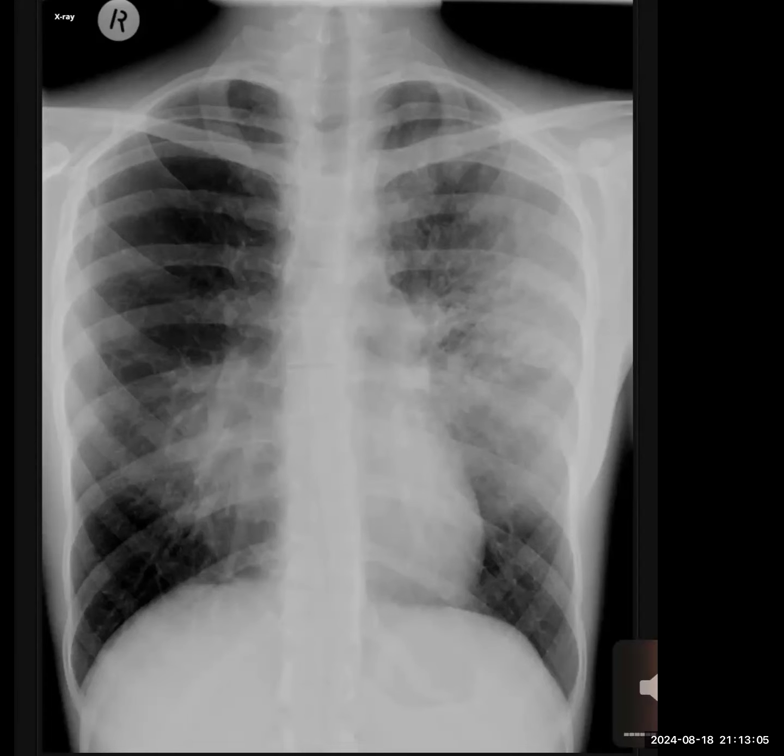I will go over the lab findings and ask for any history of any occupational exposure. To conclude, I think this is a case of pneumonia, mainly bacterial pneumonia. I would convey these findings to the referring clinician, and the patient should be kept on antibiotics. Also, the patient needs to be kept on follow-up, looking at the interval changes for any healing or not.